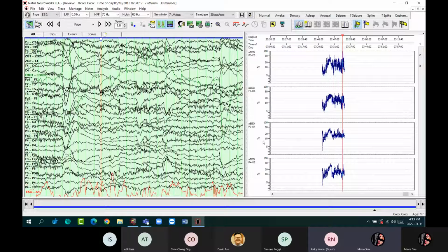The doctor doesn't know how to read the trend, because I think there's one doctor who is using the trend session for the first time. Okay. We can have some examples to show them, but not exactly telling the doctor the result of the trend summary.